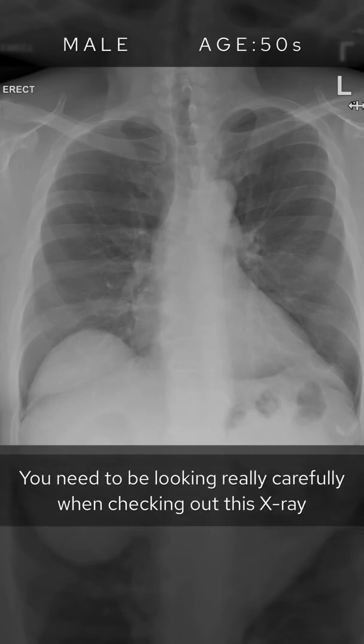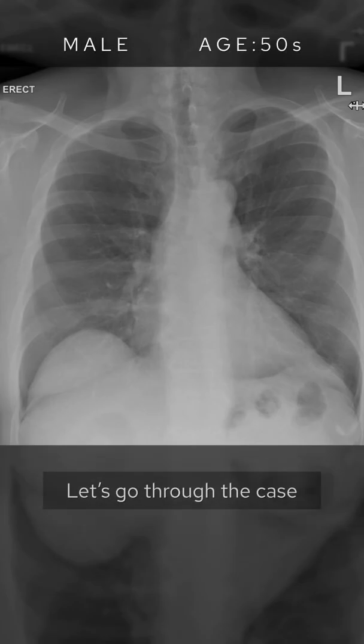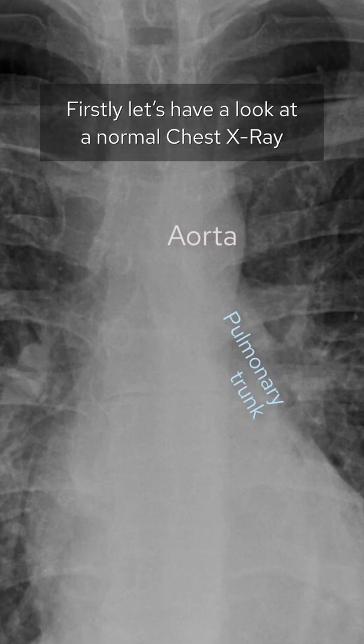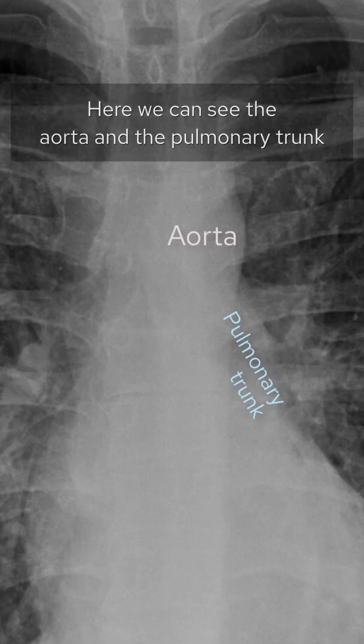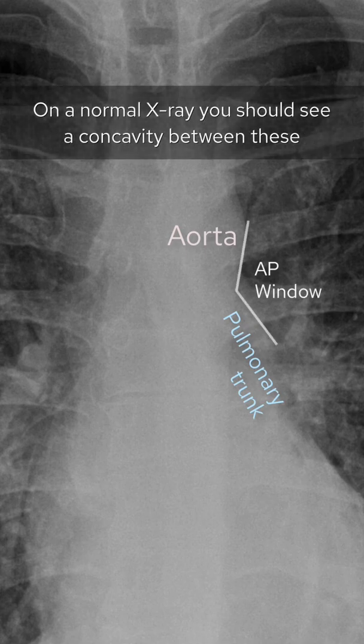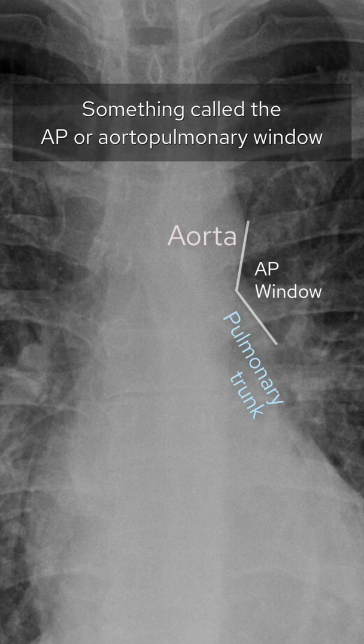You need to be looking really carefully when checking out this x-ray. Let's go through the case. First, let's have a look at a normal chest x-ray. Here we can see the aorta and the pulmonary trunk. On a normal x-ray you should see a concavity between these, something called the AP or the aortopulmonary window.